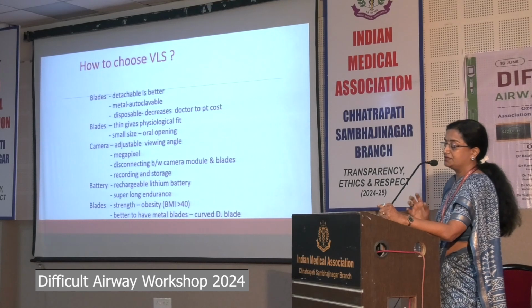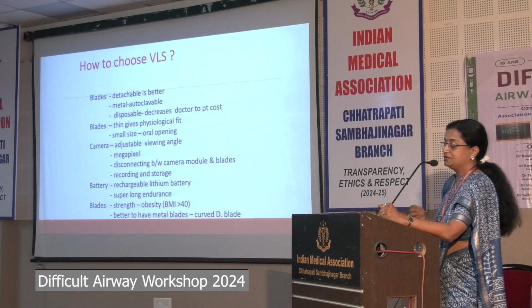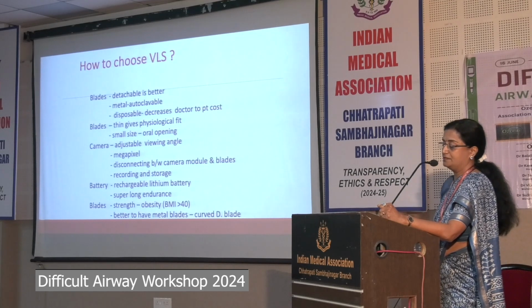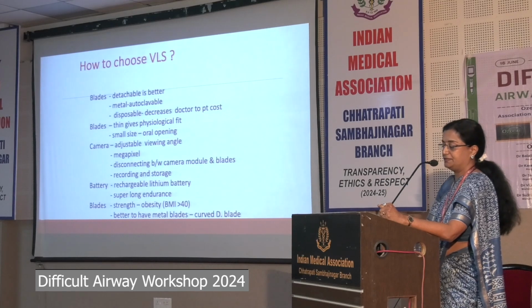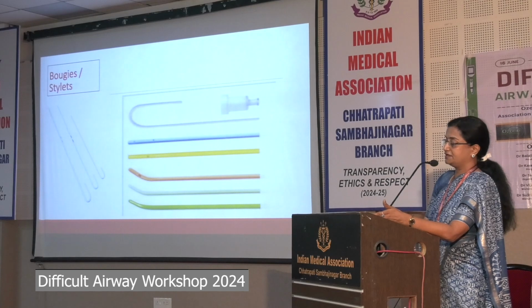Battery, it should be a good rechargeable lithium battery for super long endurance. Blade strength, especially if you're doing bariatric surgeries and obese patients, you have to go for metal blades, especially a curved D blade. Now coming to adjuncts, bougies, various bougies are available.